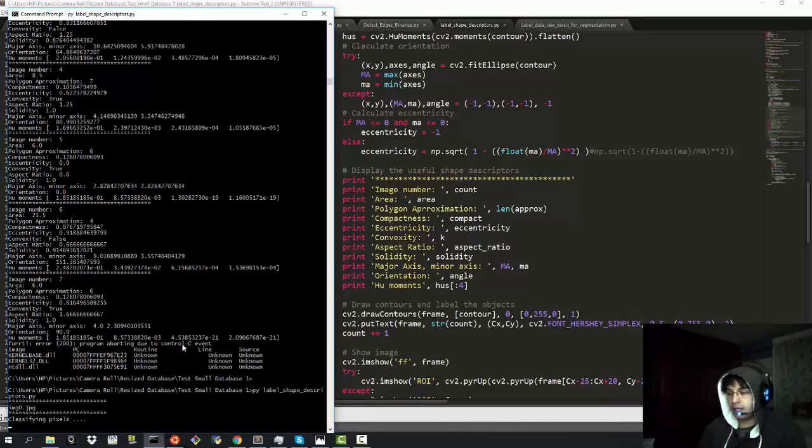Luckily I have a huge database, and by the way, this database is from tuberculosis samples that are the best of the best in the country. Why is that? Because they were made for the biggest TB detection laboratory in my country, which is from Hospital de Tórax.